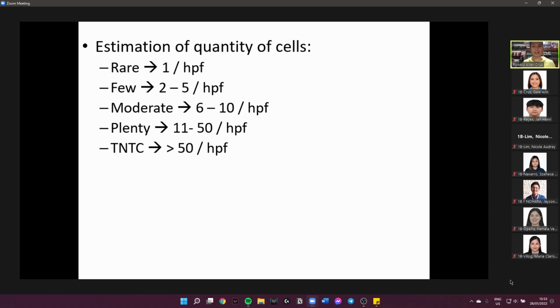So, clinical judgment. Of course, if your patient is symptomatic already, let's say your WBC count is 7 and your patient has fever or lower abdominal pain, then you might want to treat already. You could say the patient is having UTI already.